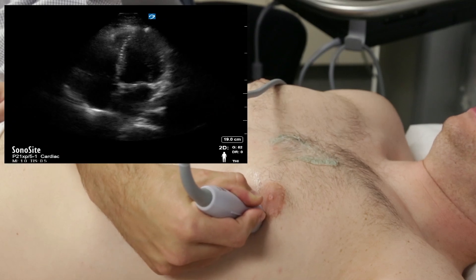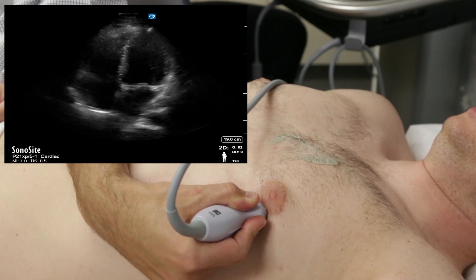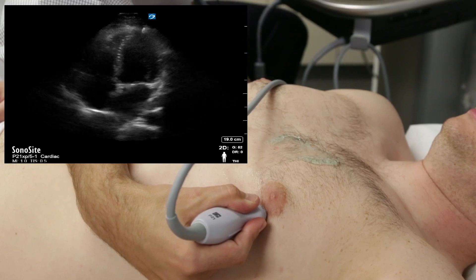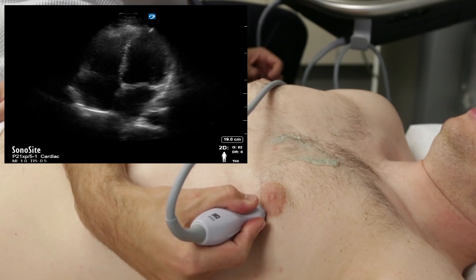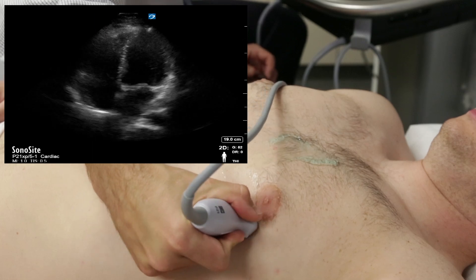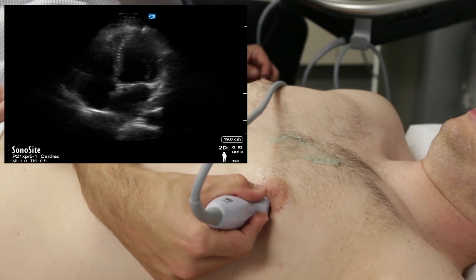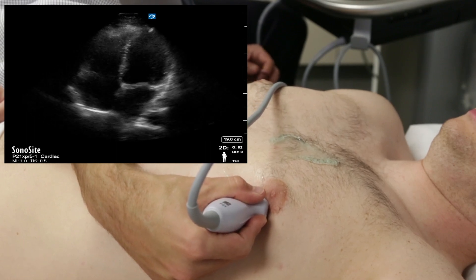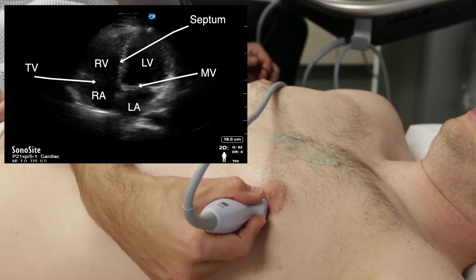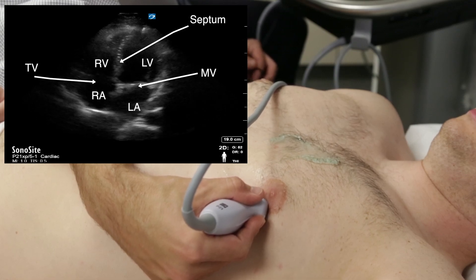Once a portion of the apical window is obtained, tilting the probe to a steep angle and pointing the ultrasound beam back up towards the patient's right shoulder will allow for a full view of all four chambers. You may have to rotate slightly clockwise or counterclockwise to bring the RV and LV cavities into a true longitudinal cross-sectional view. The ideal image should include a vertical image of all four cardiac chambers in their entirety with mitral valve and tricuspid valve in view, and the septum should be visualized hanging near the center of the screen.